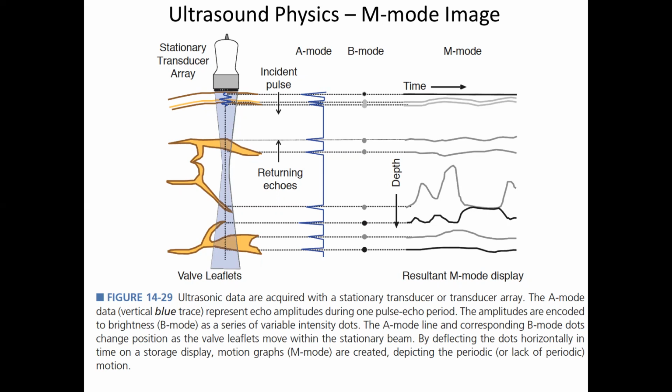And then that couples to the skin through a gel. So you kind of do this step down, right, in terms of stiffness or impedance, because if you just put the crystal right on it, you would have these enormous reflections right on that. So you want to optimize the amount of stuff that you're transmitting into the patient, right? So we'll see this, there's a little layer.